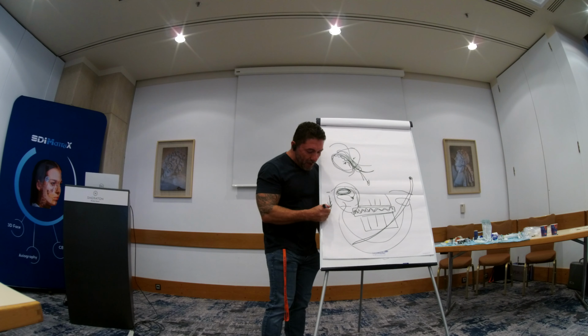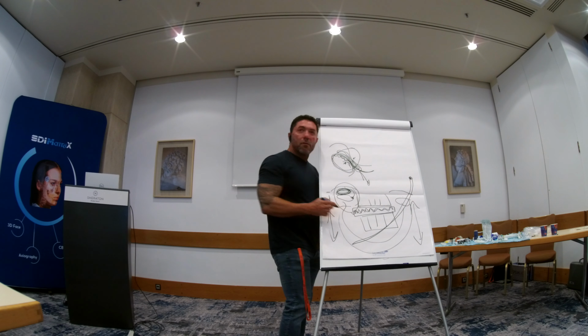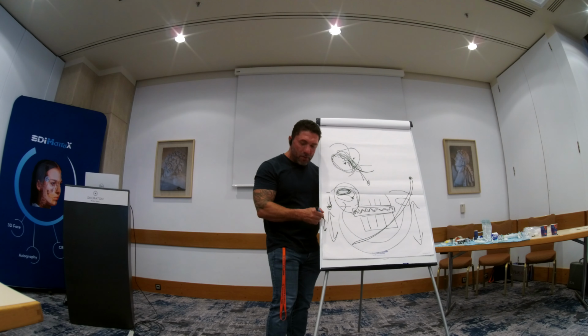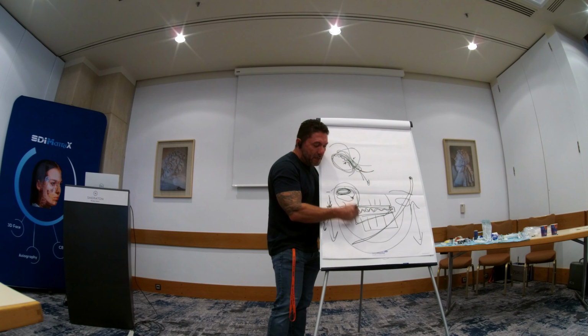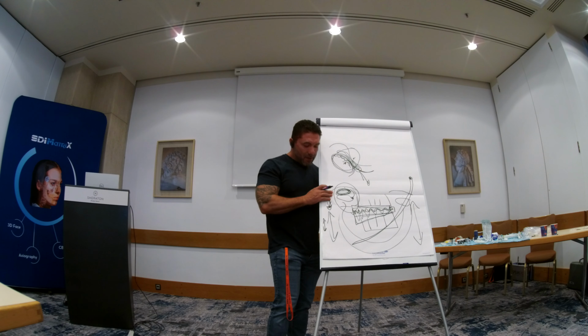And then we're going to have muscles that go here and here, that normally on the side where you have pathology, those muscles are shorter. And the function of the splint, which can sometimes be wider on one side than the other to compensate, is that the distraction is going to make that muscle elongate.